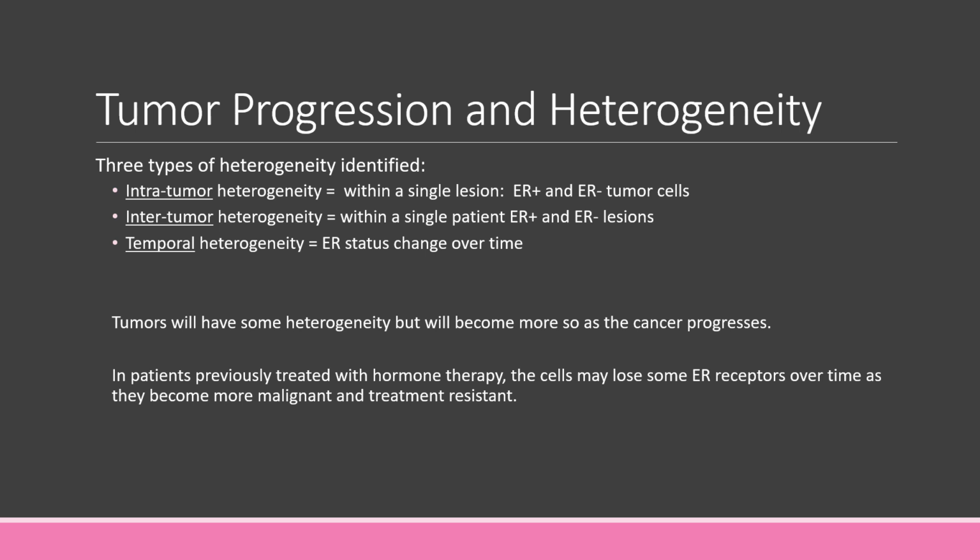So sampling those sites and figuring out the subtype and the level of heterogeneity is extremely important for managing the patient's care. I would also like to point out that two sites that are most common for having heterogeneity are the lymph nodes and the bone, bone being the most common, followed by lymph, but it can happen anywhere, and biopsy of bone can be very difficult. So that's where the FES imaging is very helpful.